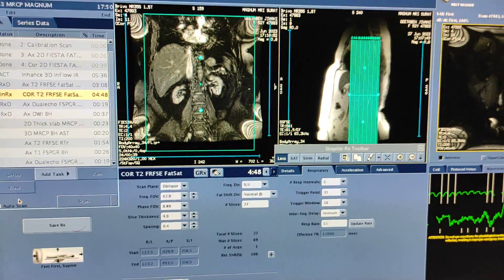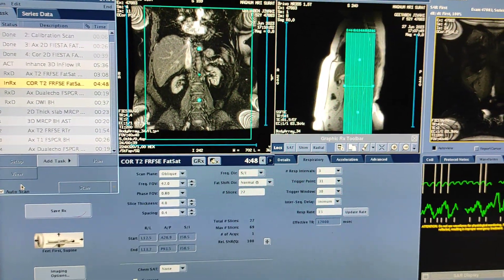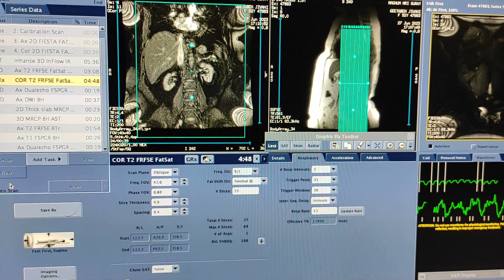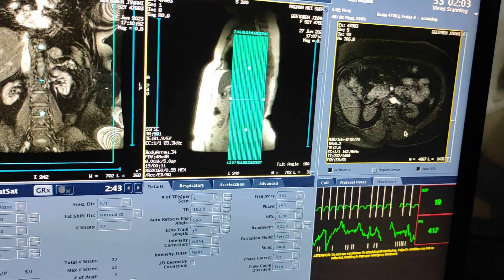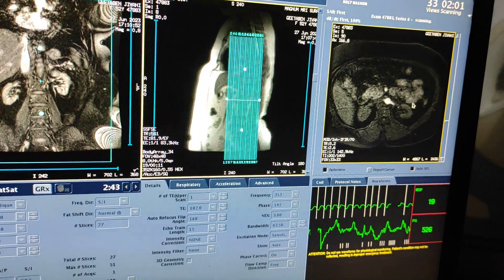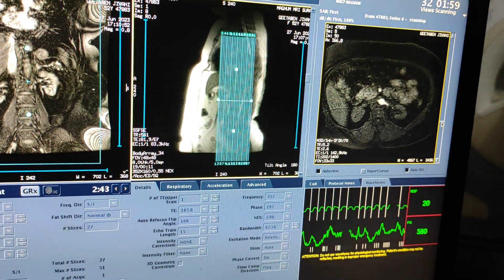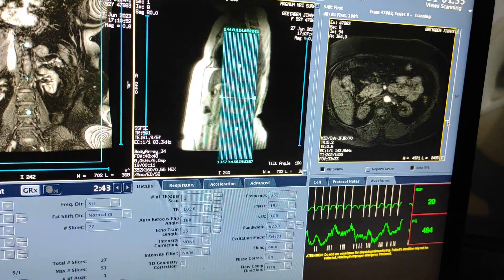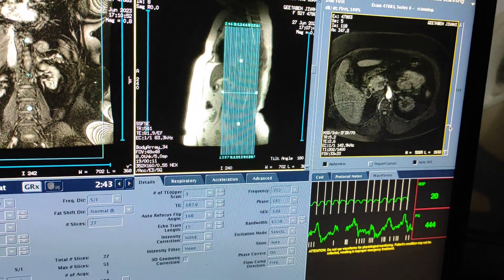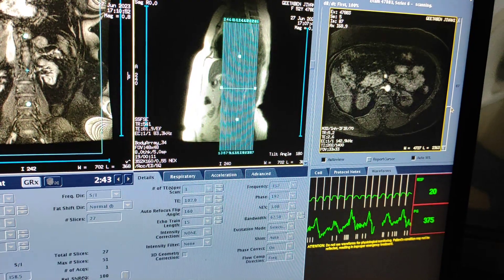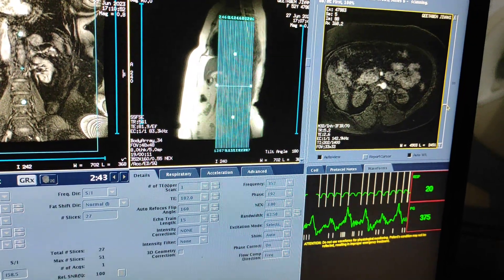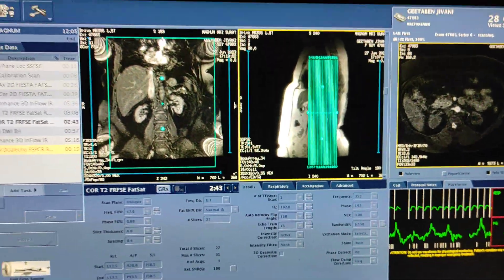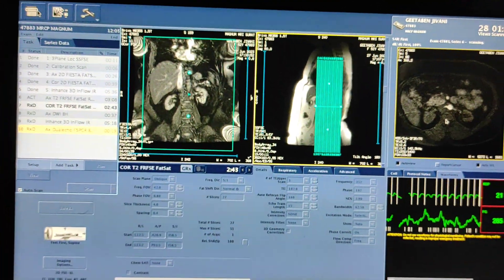I will show you after the non-contrast sequence has been displayed. Now you can see the enhanced sequence has been done. Both renal arteries are well visualized from their origin. Afterwards we have to post-process and prepare the film for this renal angio.